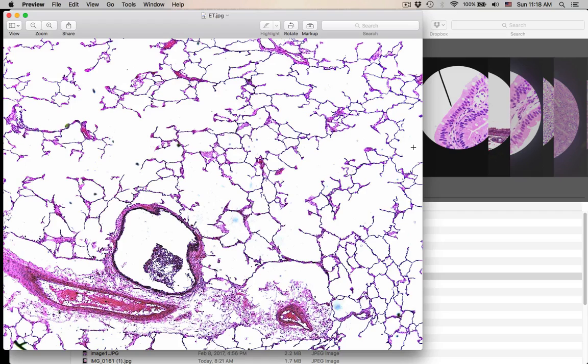Looking at this epithelial tissue that you see in through here, these are all lumens, and we're talking about this area in through here. What is the name of this epithelial tissue that you see throughout here? See it here, here you see it going all the way around. What is the name of this epithelial tissue? This is number 8.